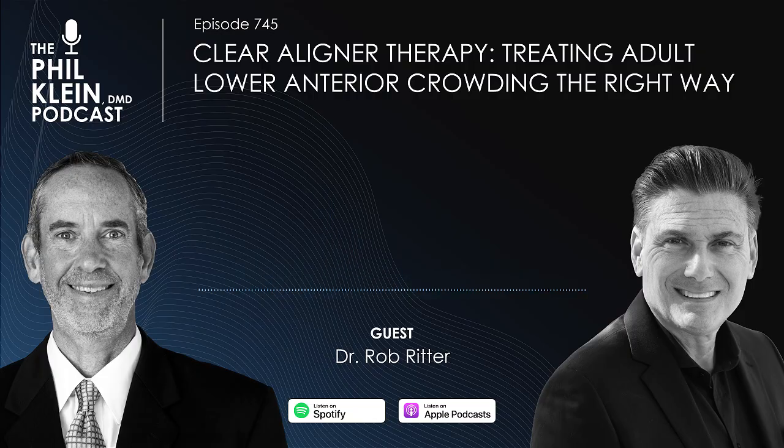Well, what you can do is obviously you can get a pan-ceph, right? You can do cephalometric tracing. You can also send those digital scans over to a company called Evident, which will go ahead and give you all the numbers associated with the position of the teeth and how much room you've got for you to determine if you can now put the veneers in place if you have enough room. Because my thing is, if we don't have the teeth in the right place, I cannot do the restorative product for you. I can't do that. And because I know it's going to fail. And I'm just not going to do that. It's not worth it to me.